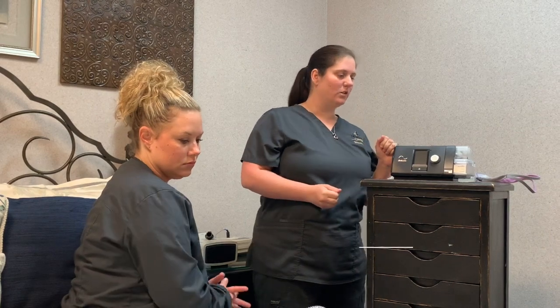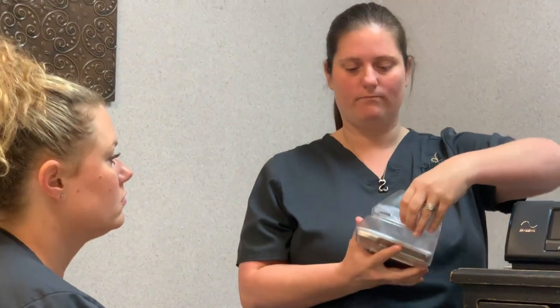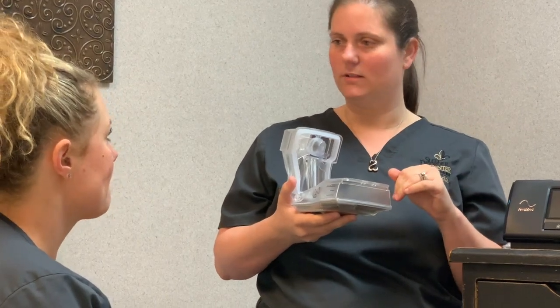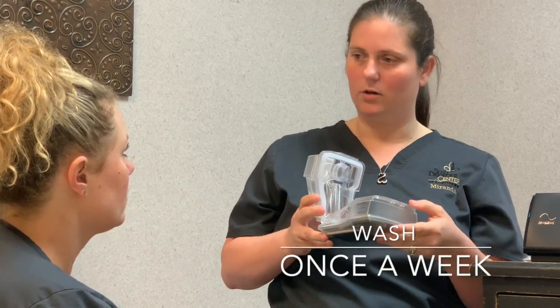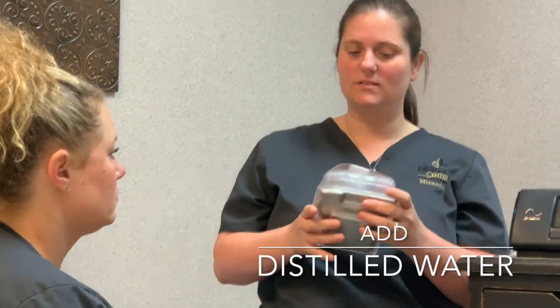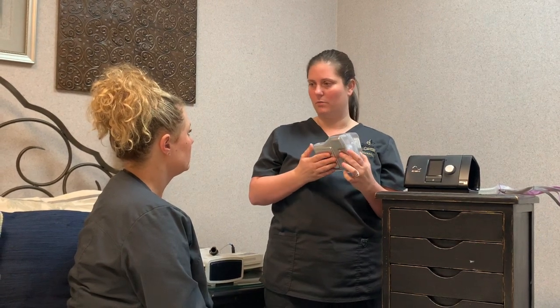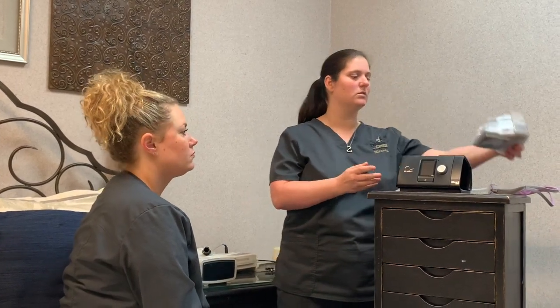Every six months you're eligible for a humidifier chamber, which is over here. It just pops out, opens on the side, and you will fill it with distilled water to your max line. You'll add water every couple of nights — just add water to what's already in there. Once a week, wash it with mild soapy water, submerge it, wipe it really good, rinse it, and add your distilled water back in. This is going to last you a really long time as long as you're using distilled water. Don't use tap water — it'll leave a nasty residue in the bottom and rust out your heat plate. If you run out of distilled water, you can use bottled water for a couple of nights.